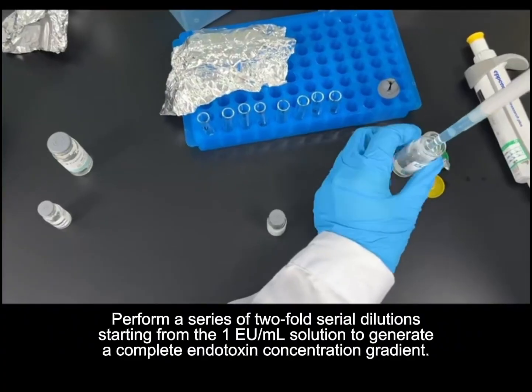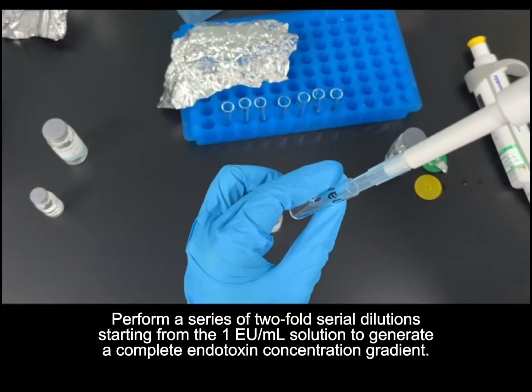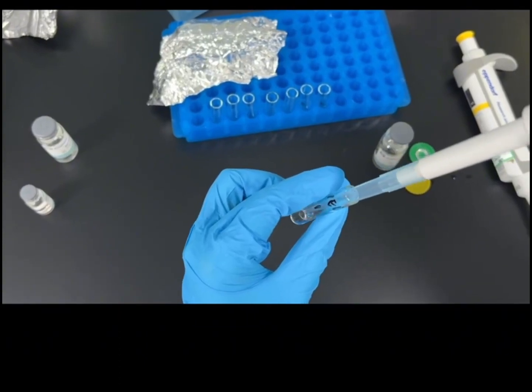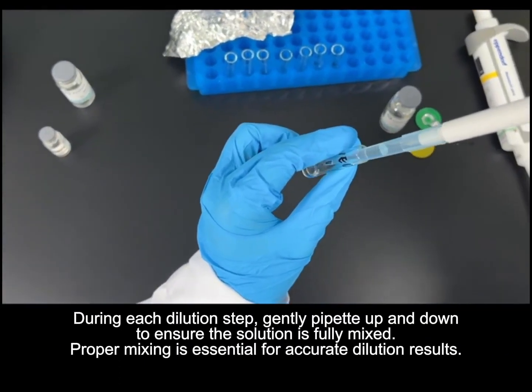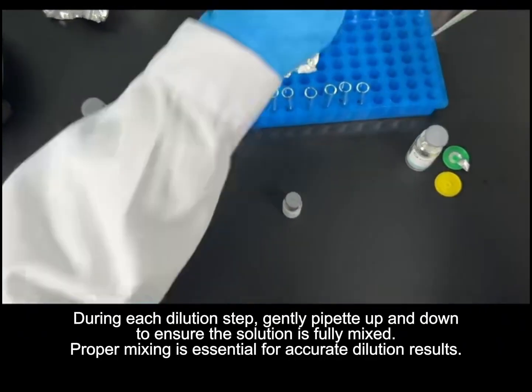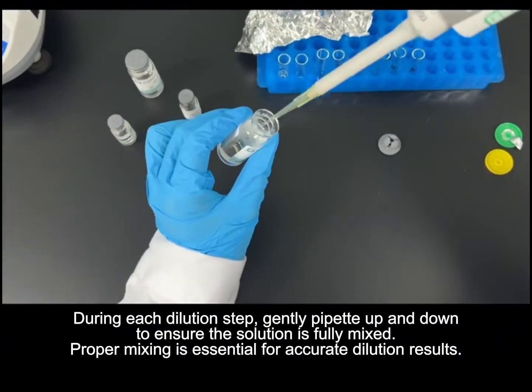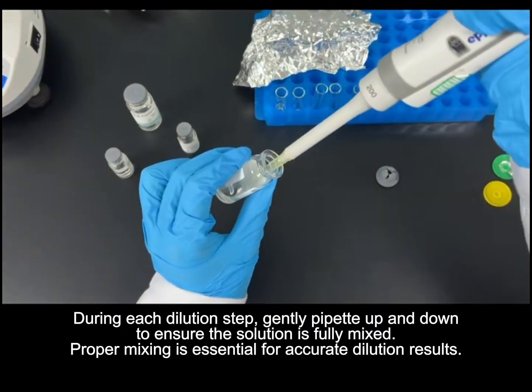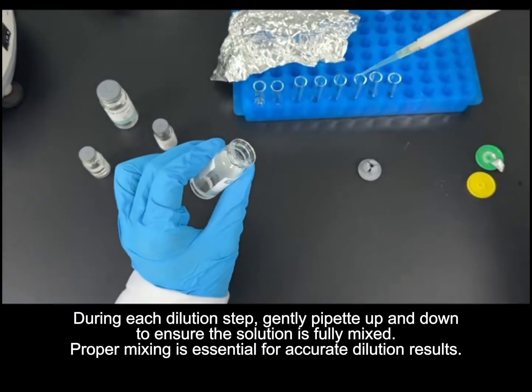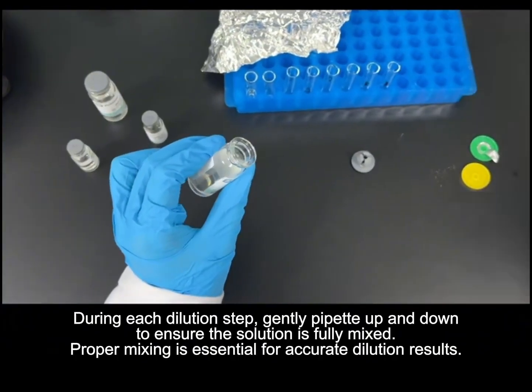Perform a series of twofold serial dilutions, starting from the 1 EU/ml solution to generate a complete endotoxin concentration gradient. During each dilution step, gently pipette up and down to ensure the solution is fully mixed. Proper mixing is essential for accurate dilution results.